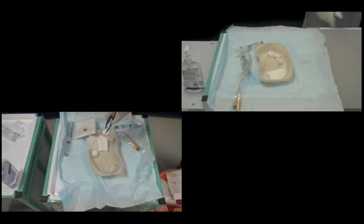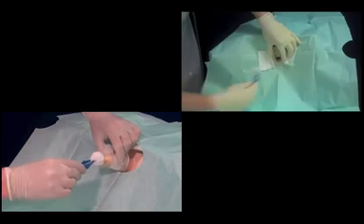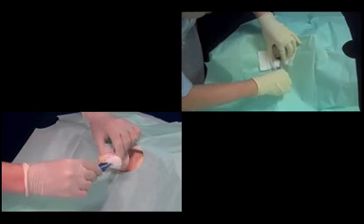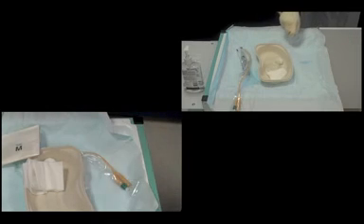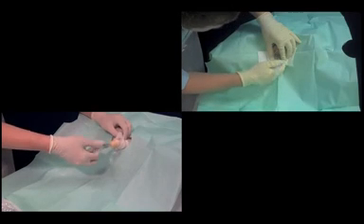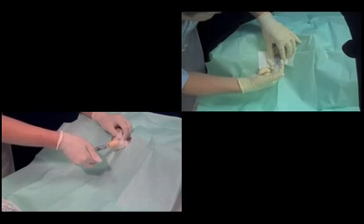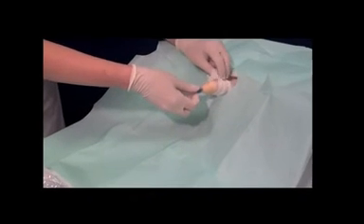With the female patient, always make sure you're cleaning from top to bottom. With the male patient, clean from the meatus outwards in concentric circles. Once you've cleaned the patient, then insert the instillagel into the urethra. You now need to change your gloves.